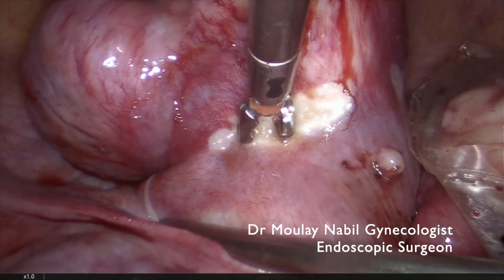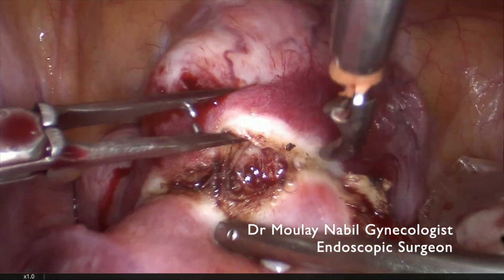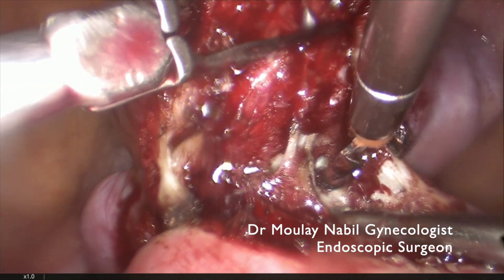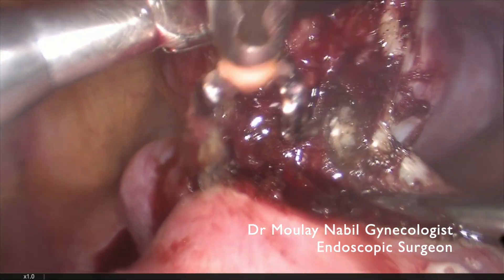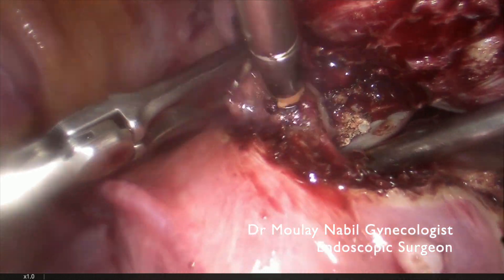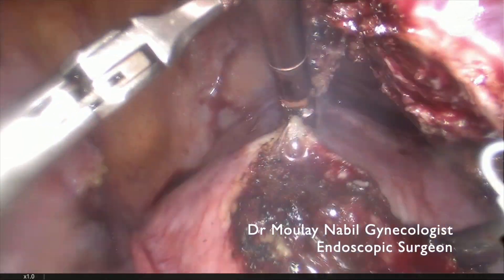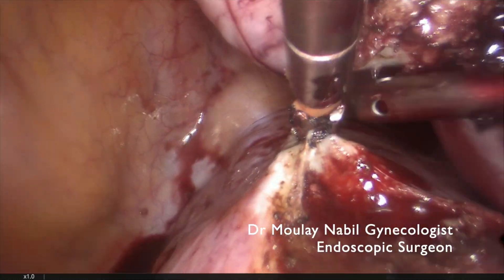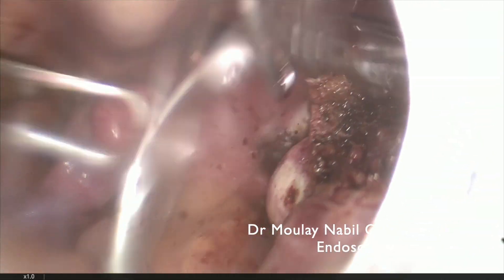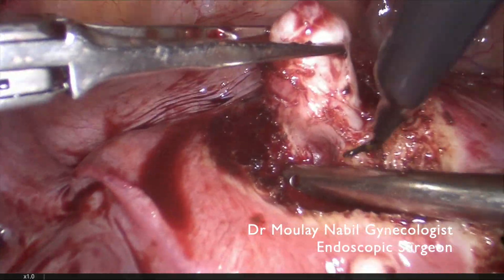For this type 6 myoma we prefer to use bipolar current. By traction and counter-traction combined with bipolar energy we can progressively enucleate this myoma from the anterior aspect of the uterus, using a small amount of energy. We can then remove this 8 cm anterior fundic myoma. Each myoma is placed inside the endobag as we continue the polymyomectomy.